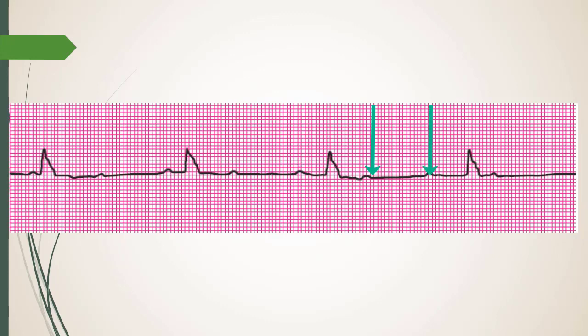So the SA node — whether this is SA node or an atrial focus — is doing its job, but the signal isn't getting down to the Purkinje fibers, and the junction isn't helping at all. That confirms third degree heart block.